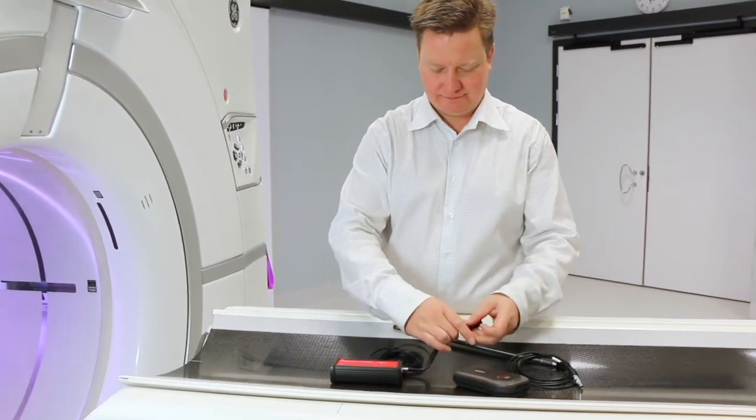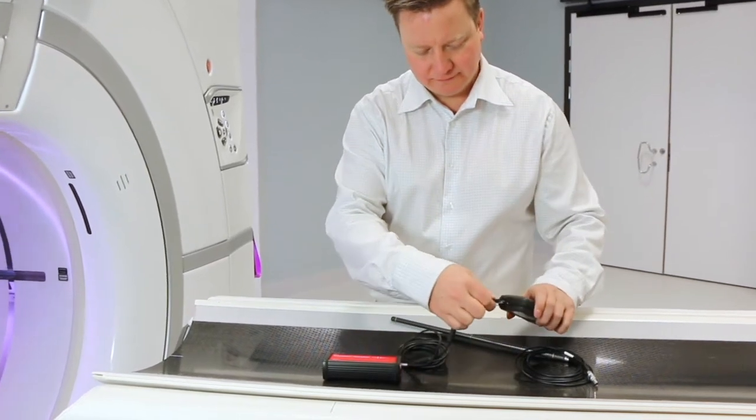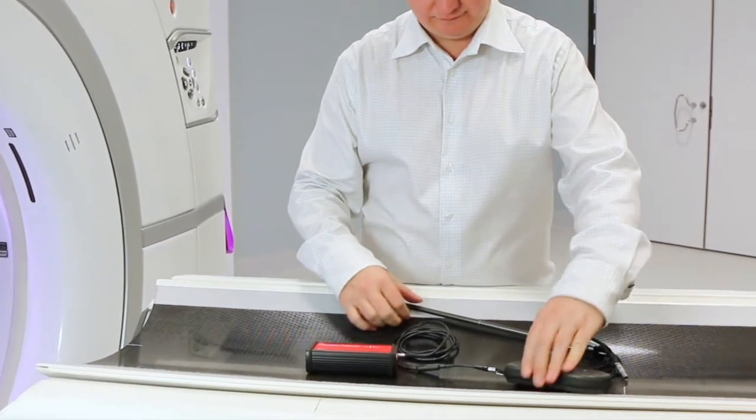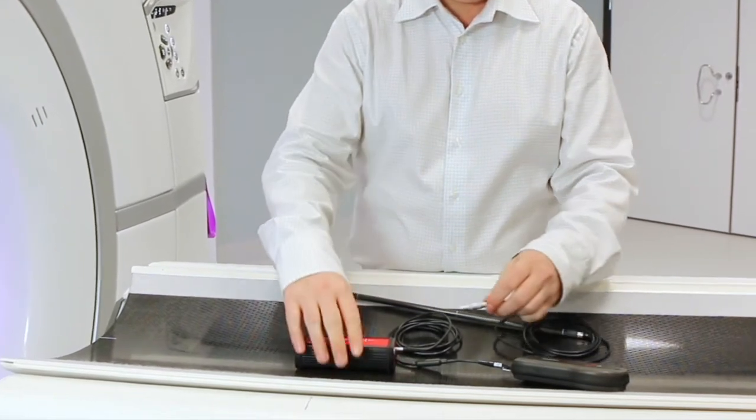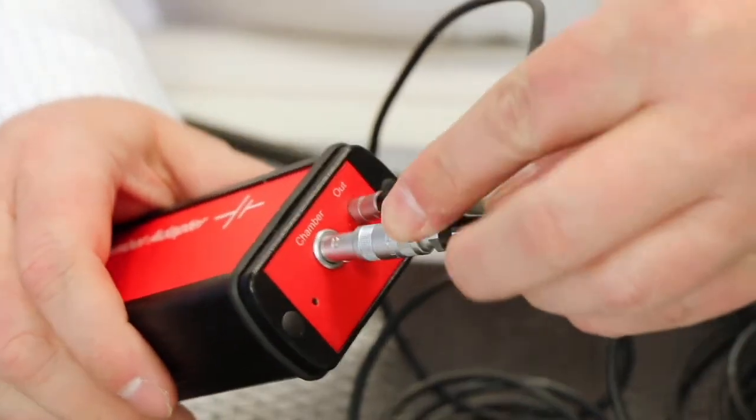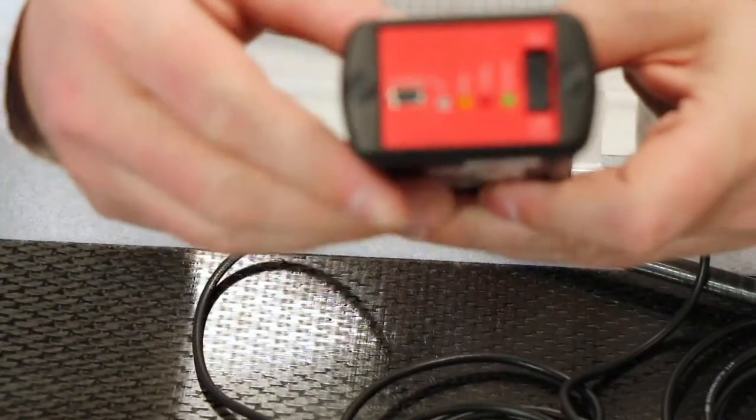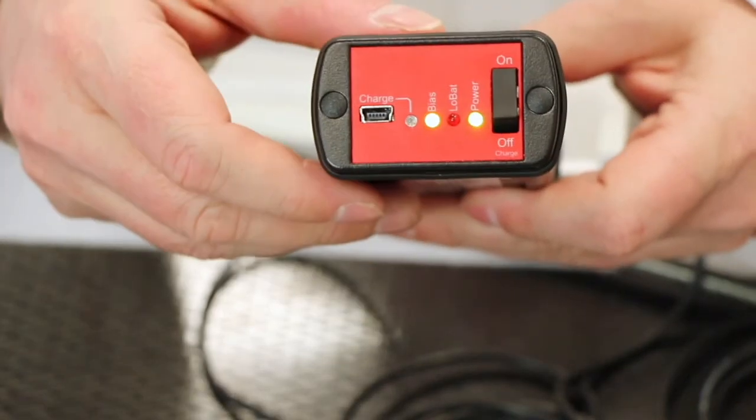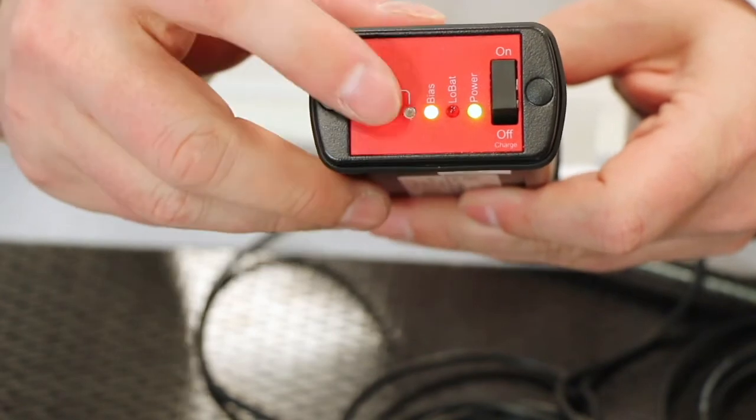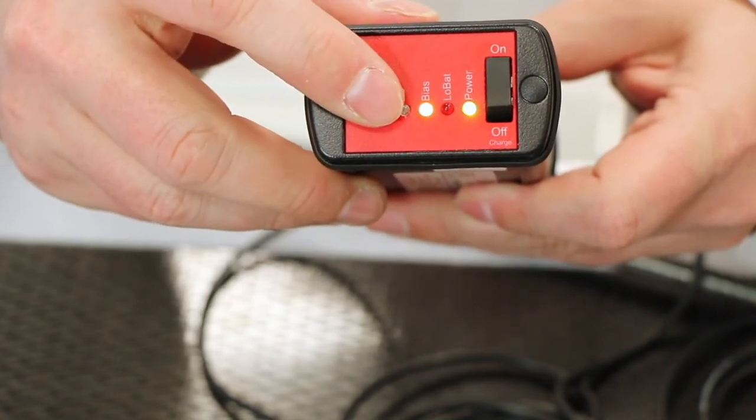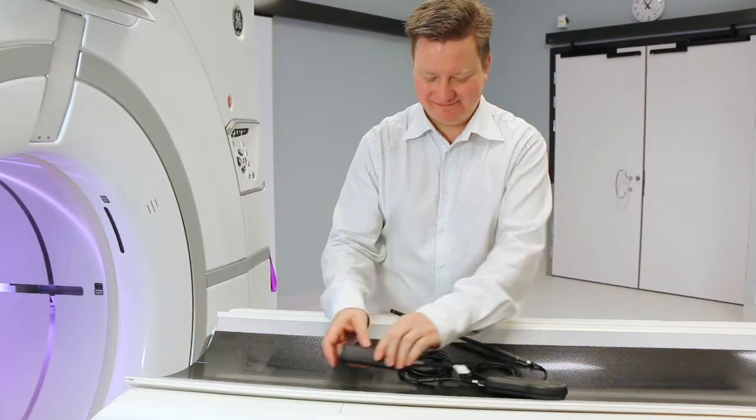To begin your first measurement, connect the chamber adapter to the piranha, plug in the CT ion chamber to the chamber adapter and switch on the chamber adapter. Note that the bias voltage will be active as long as the chamber adapter is on, therefore it is important to only connect or disconnect ion chambers with the chamber adapter switched off.